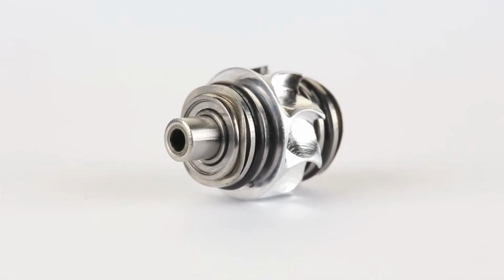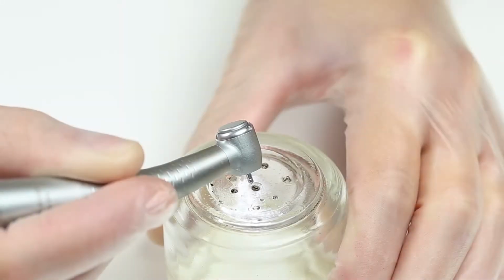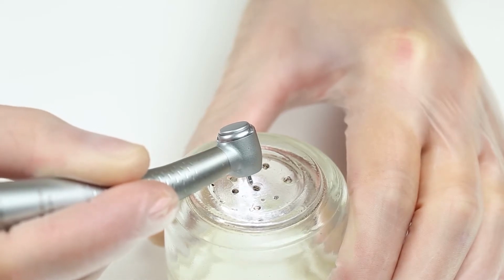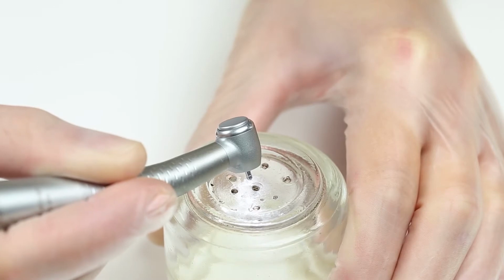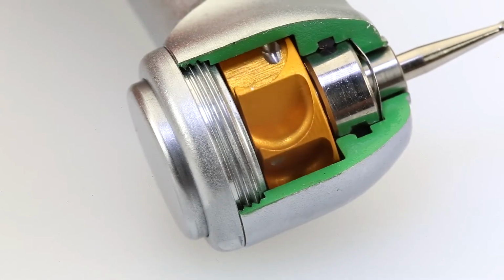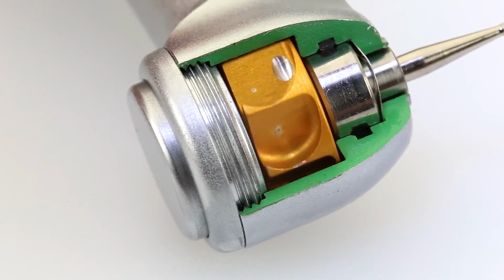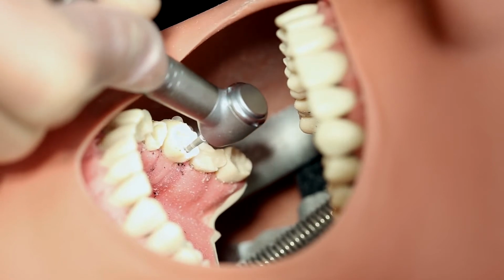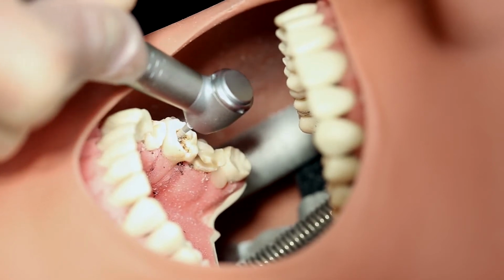As these turbine handpieces are only driven by a small rotor, their power is limited and seriously dependent on the contact pressure. Setting the speed is generally not possible, and the high-frequency operating noise is sometimes unpleasant for many users and patients. In addition, the idle mode speed is far above the required operating speed, which leads to increased heating of the tooth and more wear to the rotary instrument.